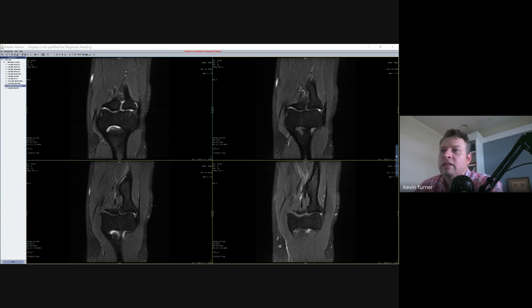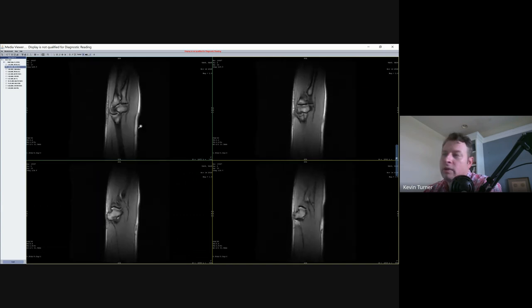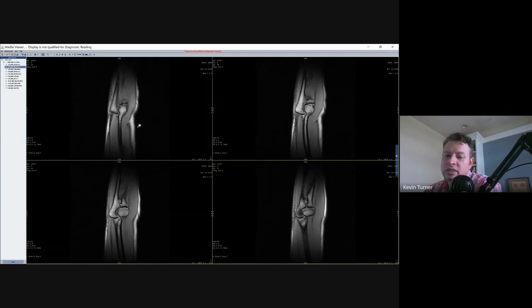Like when you run thins, the resolution is way different. Yes. And as the slices get thinner, you want to see a slice with really bad resolution? Then we look at our localizer or scout, if you want to call it that. Why does this look so much different? Because the resolution's way off. Because I wanted to run it in 30 seconds, so I could simply set up my 3-minute sequence without clipping anything and missing anything.